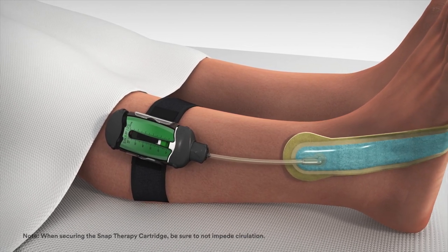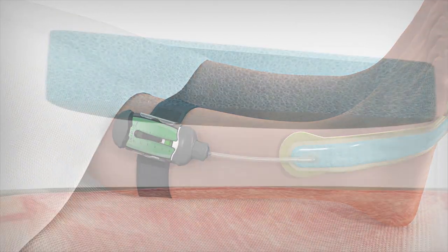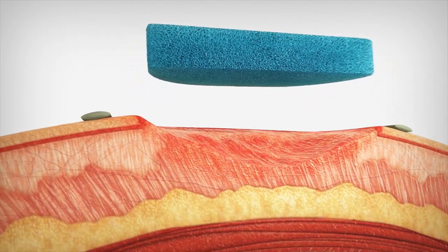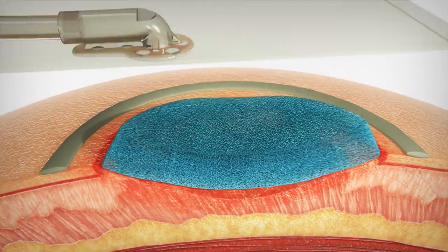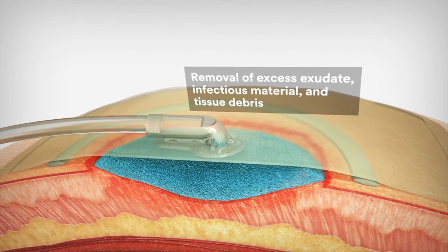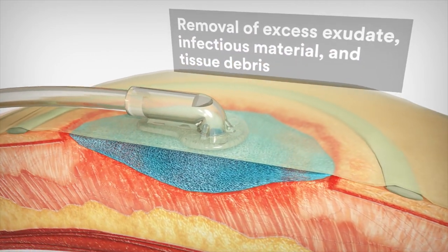Let's see the physiological effects of negative pressure. The application of negative pressure when delivered by SNAP therapy promotes wound healing through the removal of excess exudate, infectious material and tissue debris.